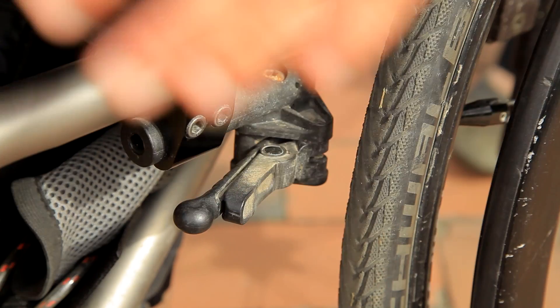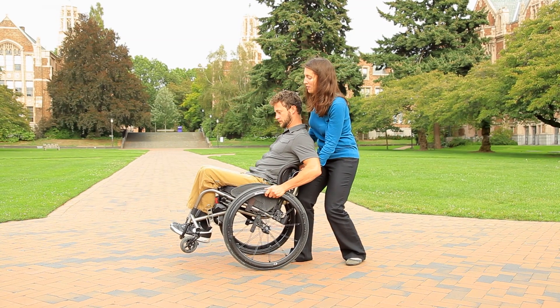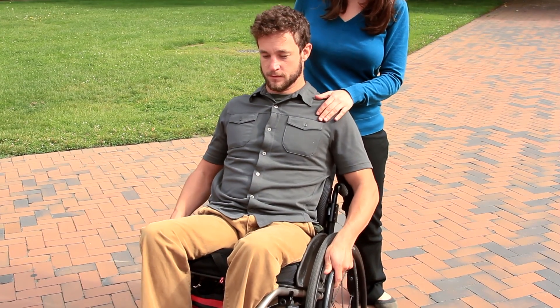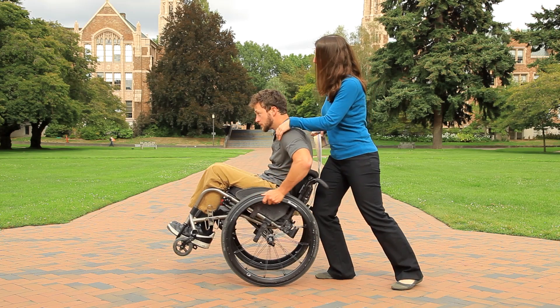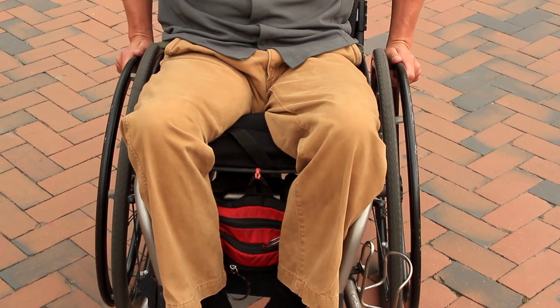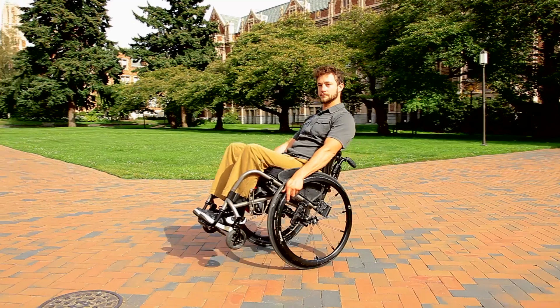Repeat this exercise with your brakes unlocked. Once a spotter tilts you back to the balance point with your brakes unlocked, practice gently rocking forward and back around your balance point by pushing and pulling on your hand rims. Avoid controlling your balance by leaning with your head and shoulders. Relax your neck muscles. Control comes through your hands and wheels. After you've experienced your balance point, progress to moving into the wheelie.